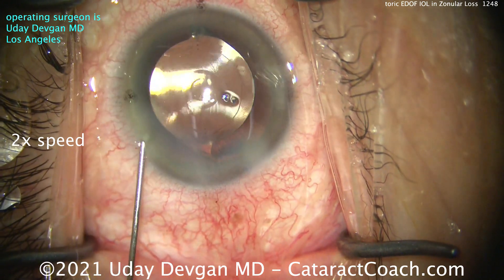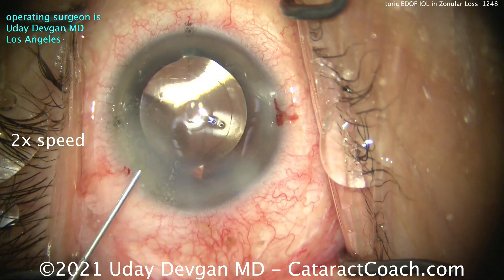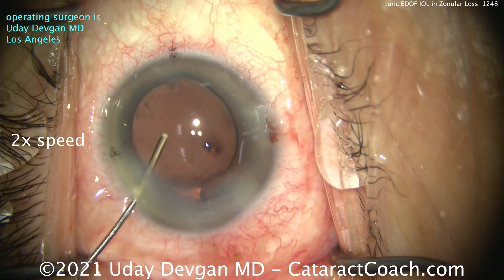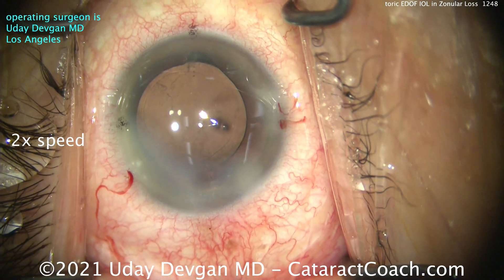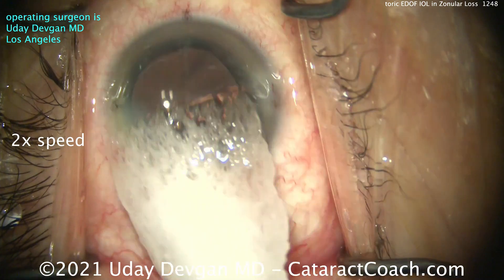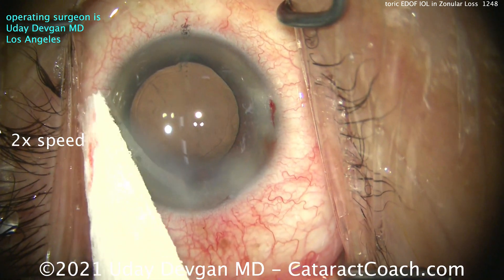This case took me 20 minutes — a long case for me. I want to show you all my cases: the ones that are slam dunks and look beautiful and elegant, and cases like this where I worked hard and struggled a little bit. Because the outcome is going to be great. Those Purkinje images lined up beautifully in the center of that extra focusing element on this EDOF lens — this is the Alcon Vivity. The toric axis marks are also precisely done. Now look at the cornea — there's already some corneal edema. This is very involved surgery, and that's okay. The patient will heal up fine. Nice stability of the lens, no pseudophacodonesis, no shaking of the lens.